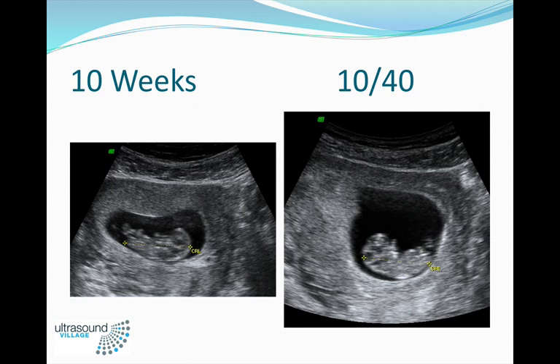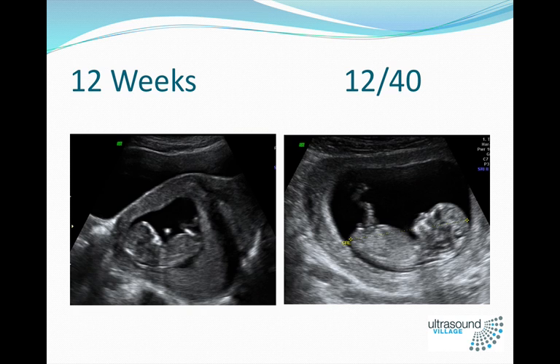10 weeks, here we have it. 12 weeks, here we have it. Here's our nice little nose, lips, chin, and we're starting to see a proper looking fetus.